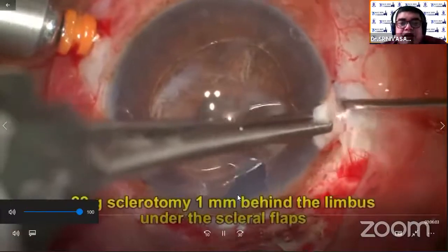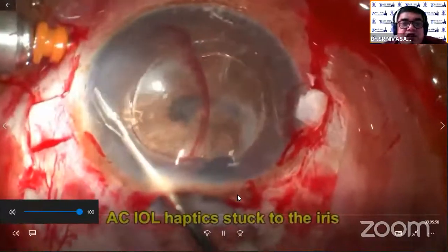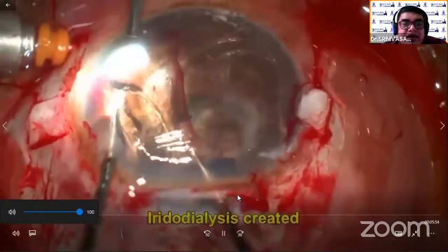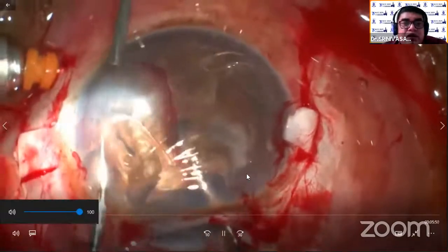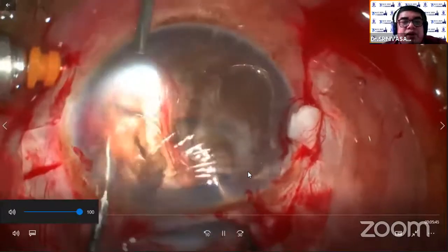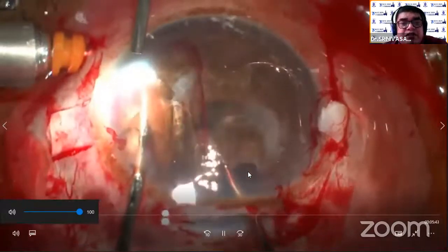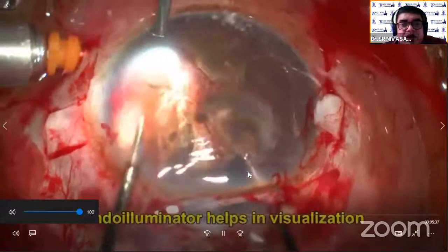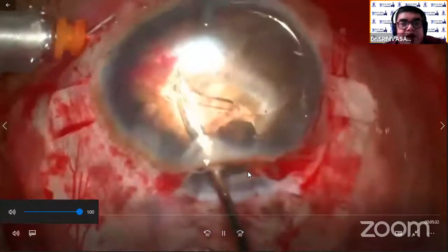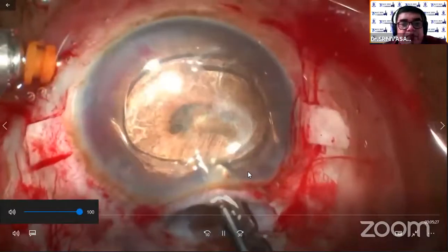Here, I'm trying to move the intraocular lens. But as you see, the haptic is clearly stuck with the iris. I'm trying to remove it and it's not moving. And as I see, I created an iridodialysis while doing that. I would like to tell everybody — in all these situations, try to keep an endoilluminator for better visualization in all these difficult cases. Even in spite of trying this, I'm not able to move the haptic clearly. So I decided that the haptic is stuck and cannot be removed.